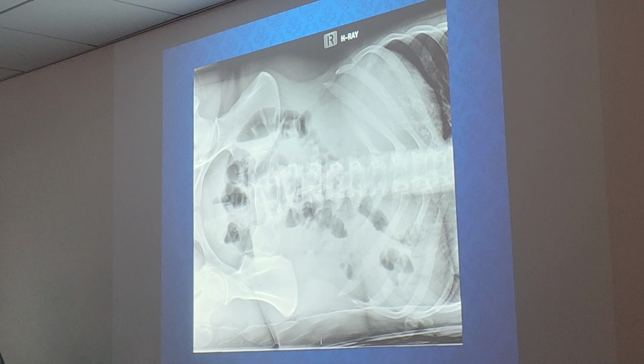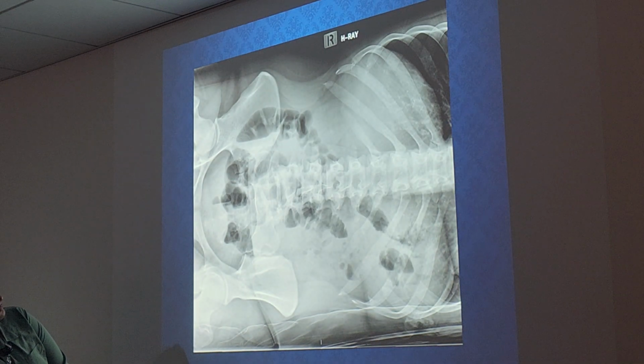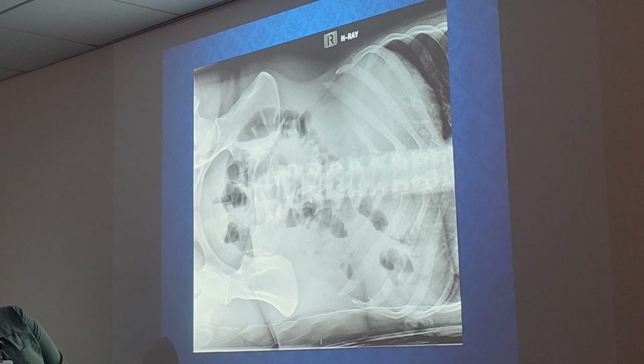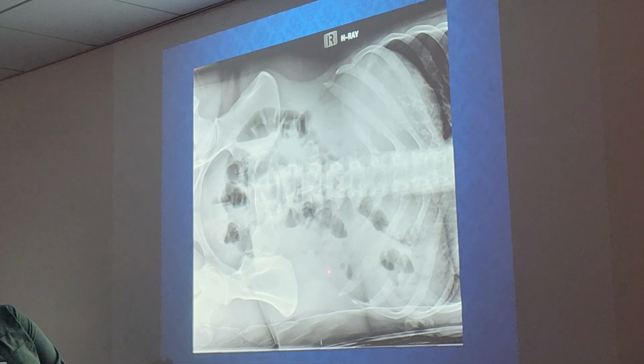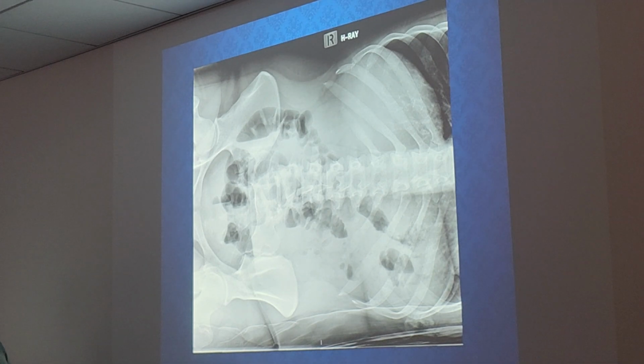Where else do you see it? I think it's there and then along the left side, where you were pointing, as you follow that colon down towards the left. There's a whole bunch of air fluid. Not sigmoid, it's more towards the left side. Oh, right there. Yeah, I'll be honest, like she said, some of these air fluid levels aren't the most clear.